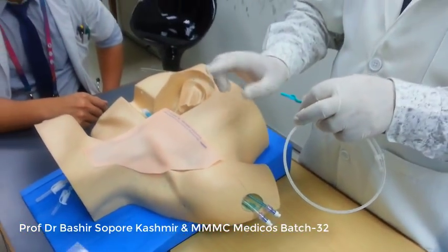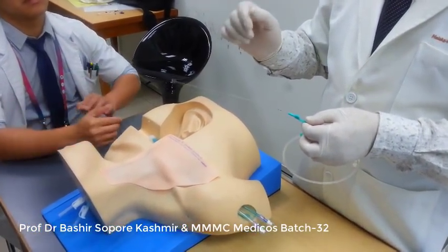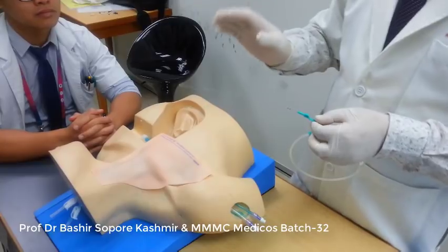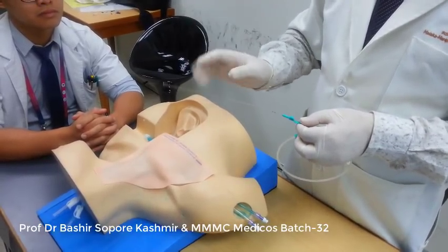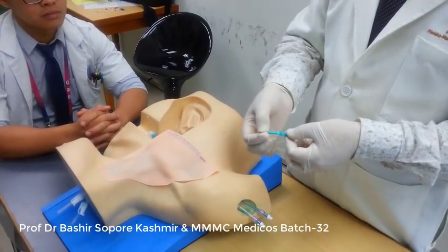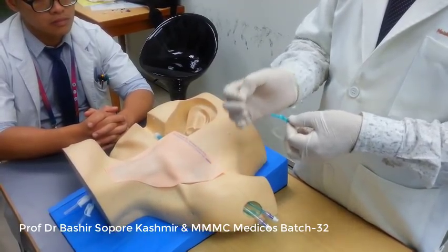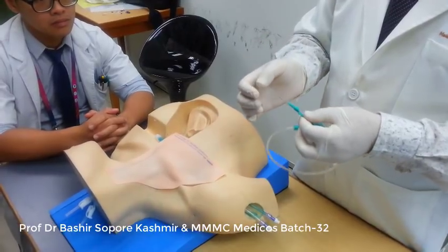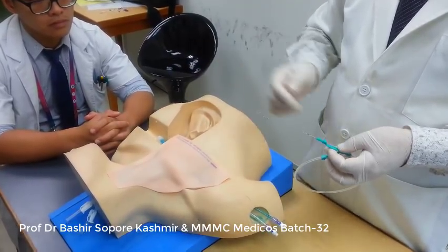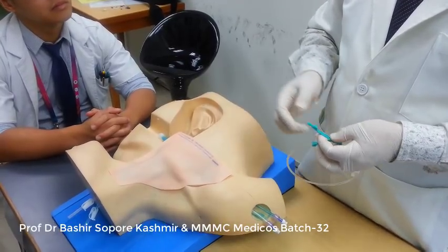So you can also see, because you know that you have to introduce the catheter only 15 centimeters. But I will tell you later, it is not exactly 15 centimeters. It has to be less. You understand that? I will give the reasons for that. First of all, you see that there are markings. One is 10 centimeters, we have just measured it. The other is another 10 centimeters. That means if you have to go up to 15 centimeters, then you have to go up to here, isn't it? Because if you introduce this catheter too far, it may go into the right atrium and it may damage the heart. You got my point? So it has to be exactly around 15-16 centimeters.